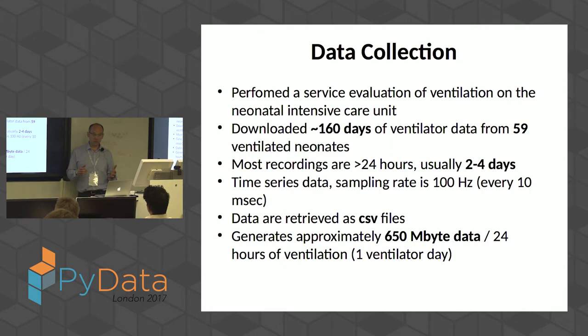So this leads to a large data set when you're recording for 2 to 4 days, which is the typical recording length for me. These data are retrieved as CSV files, so you're looking at approximately 600, 700 megabytes of data per ventilation day. That's not much if you think a whole unit's ventilation activity could be recorded on a 1 terabyte disk, but it's not done. We don't keep this data at the moment. Similarly to other hospitals, we never keep this data.